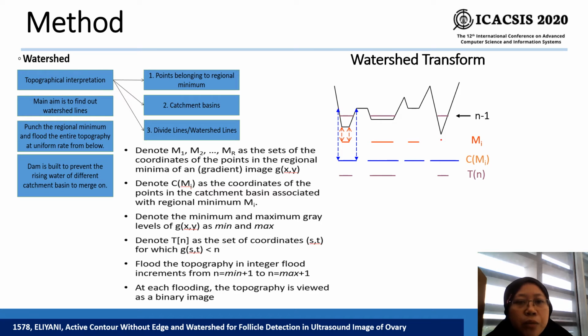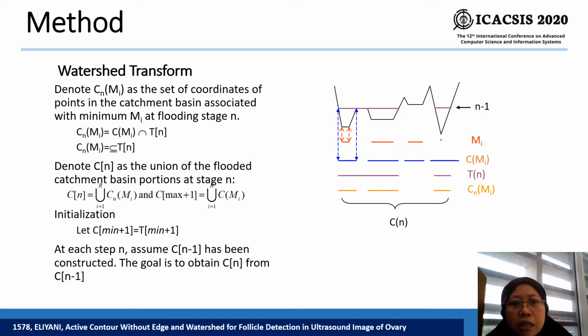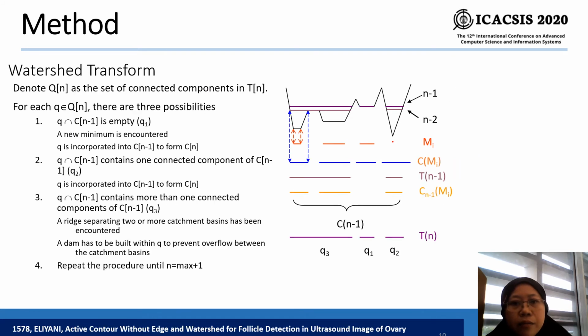A dam is built to prevent the rising water of different catchment basins from merging. This is a watershed transform, and this is the dam.